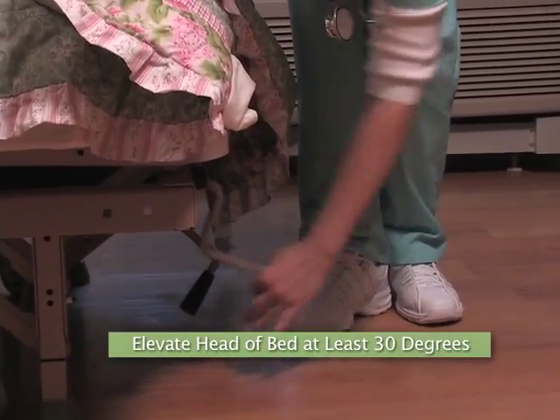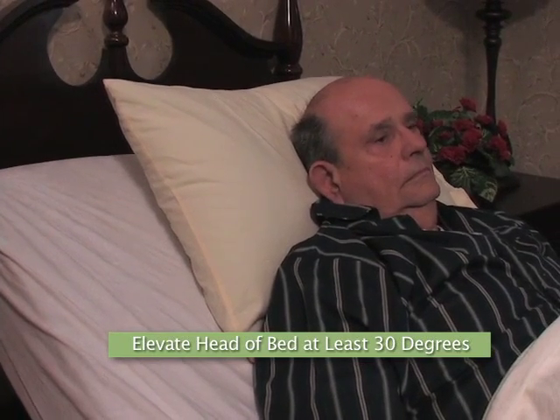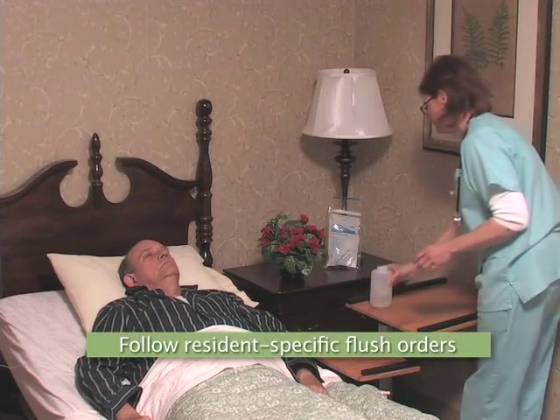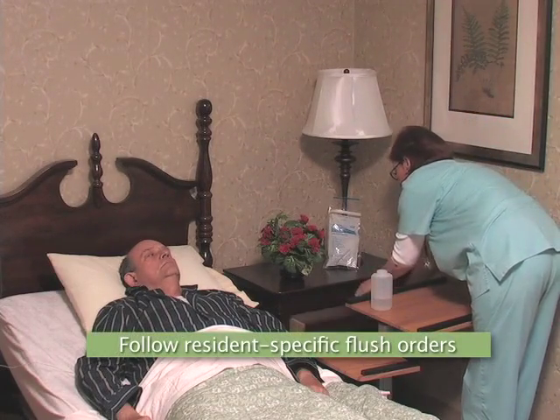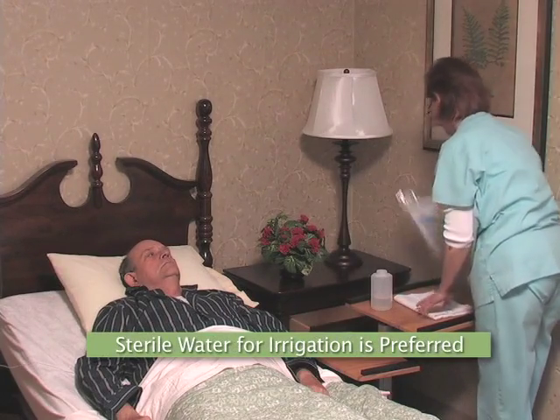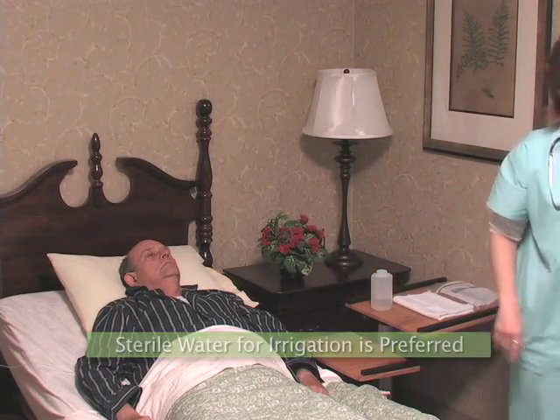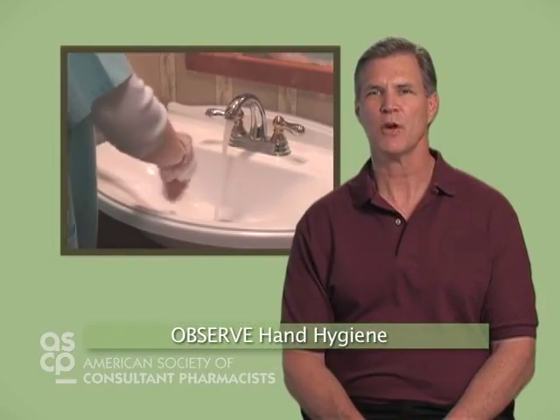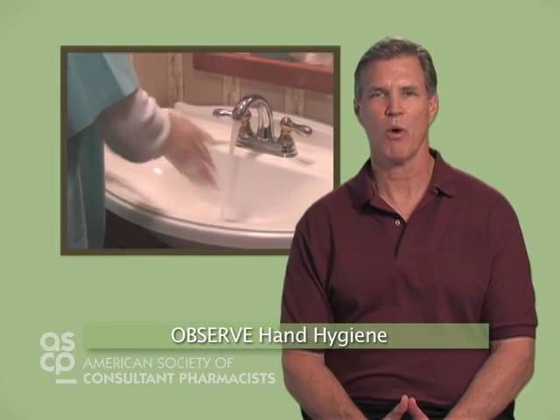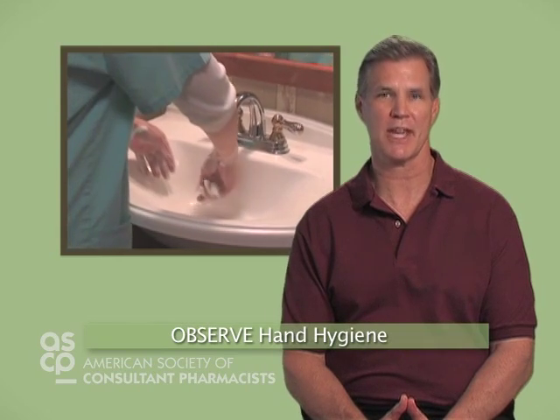The nurse completes the preparation of the setting by ensuring Mr. Hansen's head of the bed is elevated at least 30 degrees. The nurse measures a total of 200 cc's or milliliters of water to dilute medications and flush Mr. Hansen's tube, and places it at the bedside along with the linen saver. Take note that the nurse observes hand hygiene practices by washing hands prior to returning to the medication cart to prepare medications.